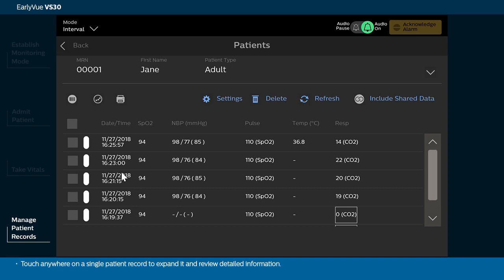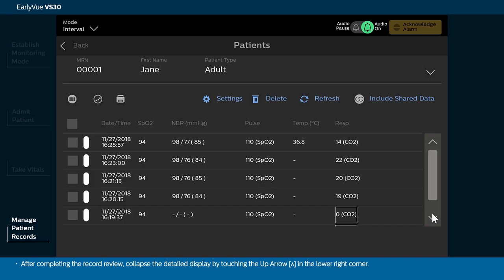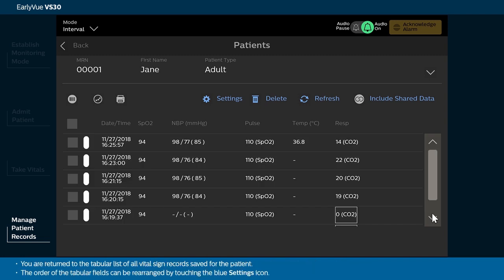Touch anywhere on a single patient record to expand it and review detailed information. After completing the record review, collapse the detailed display by touching the up arrow in the lower right corner. You are returned to the tabular list of all vital sign records saved for the patient. The order of the tabular fields can be rearranged by touching the blue settings icon.